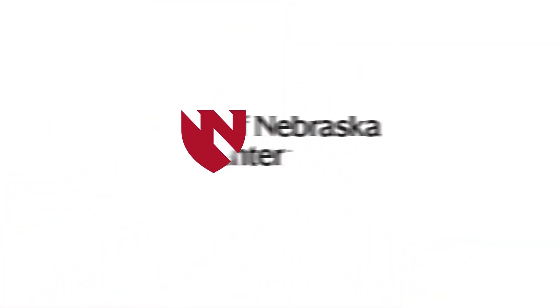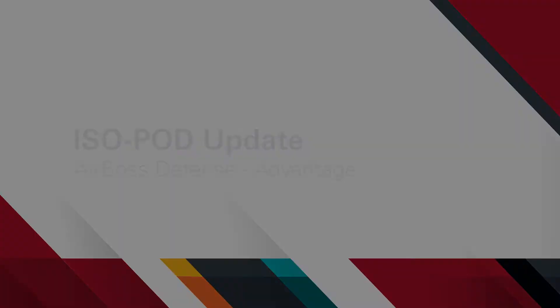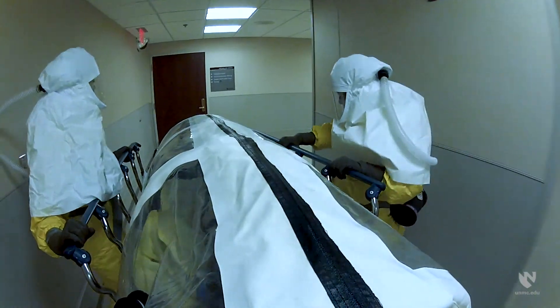In this video, we will highlight the updates that have been made to the current generation of the isopod. Safe transportation remains one of the most important components in caring for patients with highly infectious diseases. An isopod is one device that can provide a safe environment during that time.